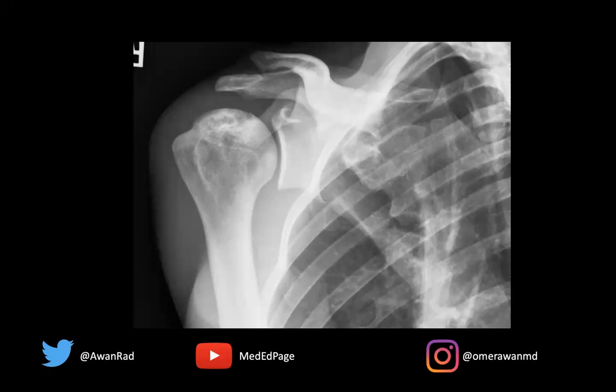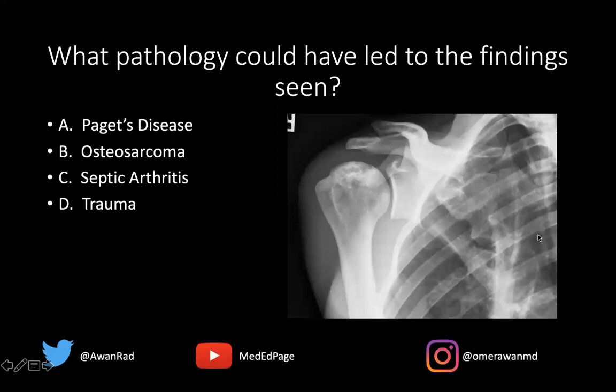Hello everyone, and welcome to MSK Unknown Case Series, case number 51. Here we have a frontal view of the right shoulder, and the question is: what pathology could have led to the finding seen? Is it Paget's disease, osteosarcoma, septic arthritis, or trauma?